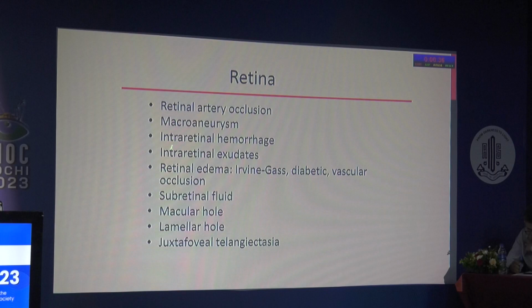I am just making the routine lineup for the diseases. Important areas will be retinal edema. Again here OCT has come in handy for us. You operate a good cataract, you have no problem, but the patient suddenly complains after 2 weeks or 10 days that vision has gone down. You are worried and you do an OCT and you find edema, then you can reassure the patient. Most of these patients will improve on their own. You just have to wait.